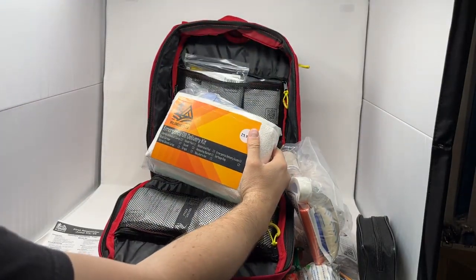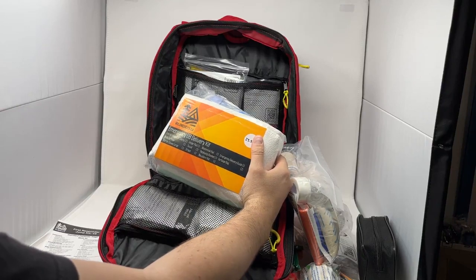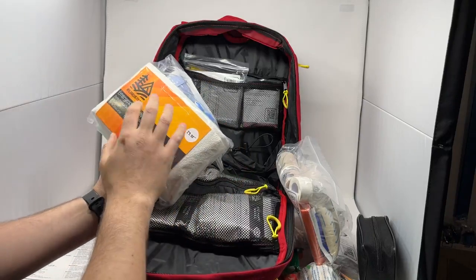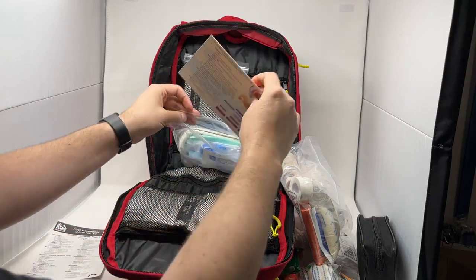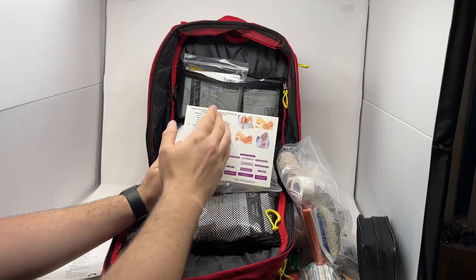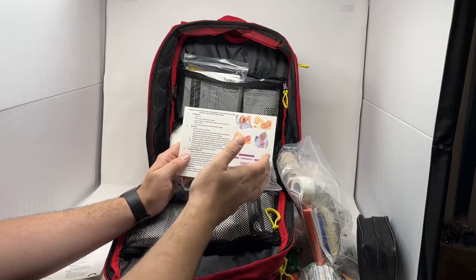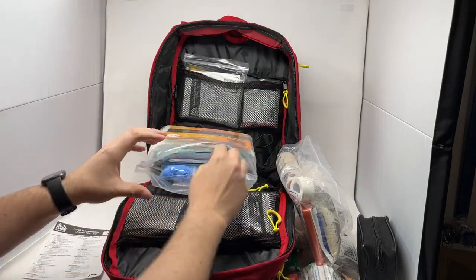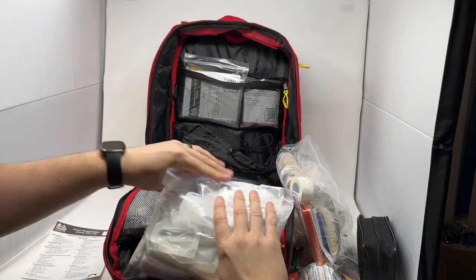We have our emergency OB delivery kit. Definitely not something we commonly come across, but if you do, it's nice to have all the tools and the reminders. This has everything for assisting with the delivery of an infant in a pre-hospital environment, as well as a review card on the back walking you through the steps of what to do, including if the infant needs some level of resuscitation. It has all the tools to keep everything clean and sterile while assisting with that event.